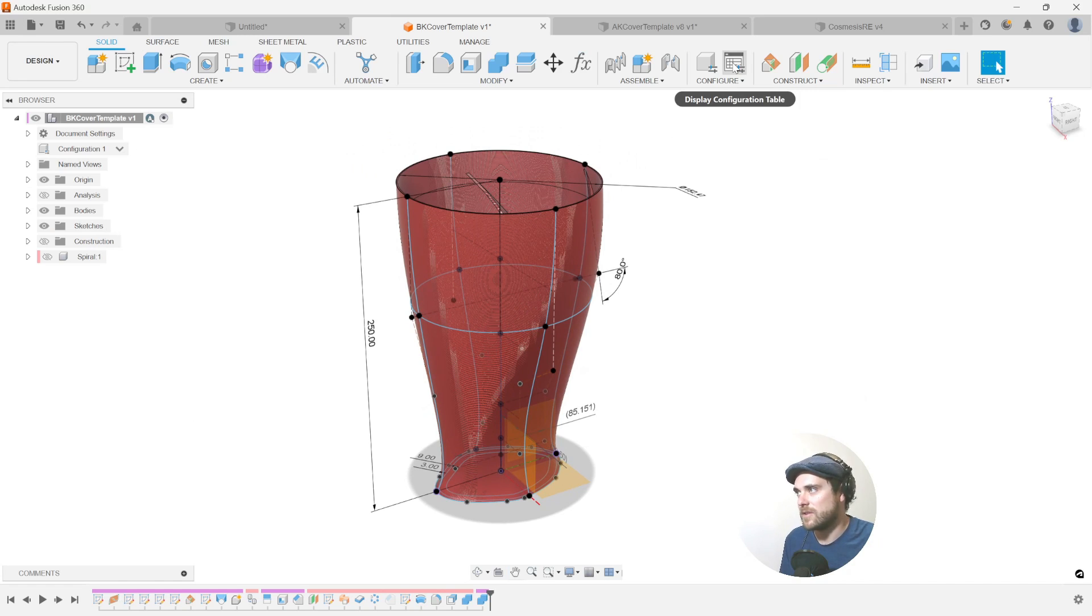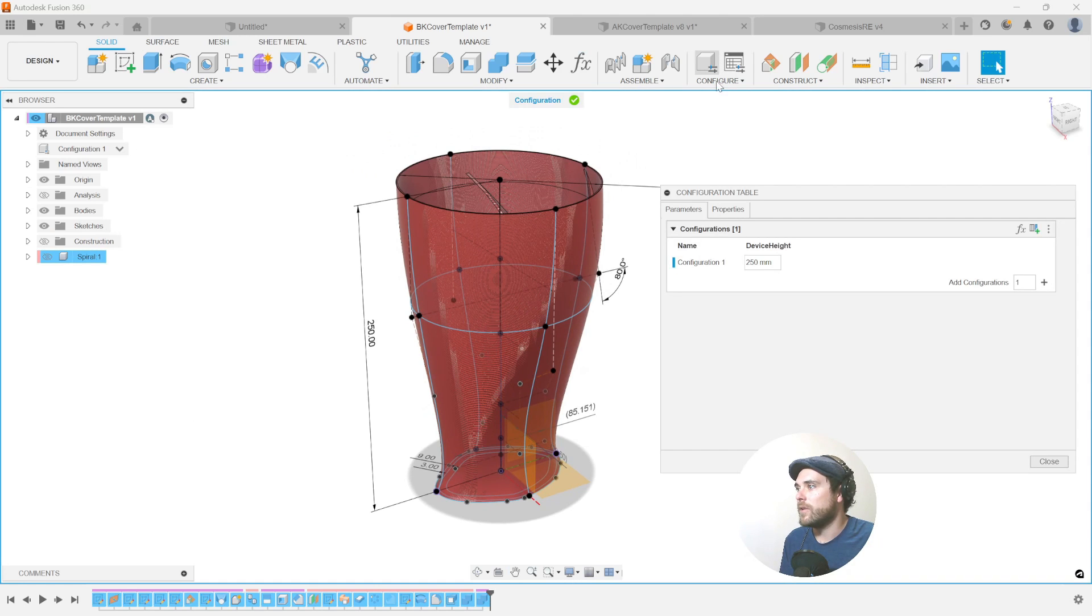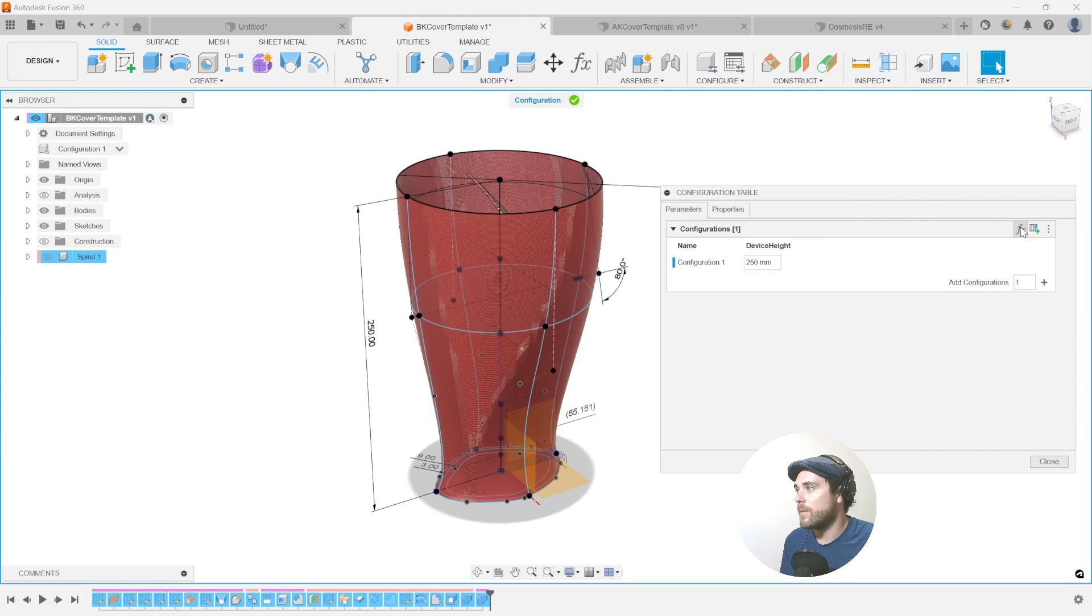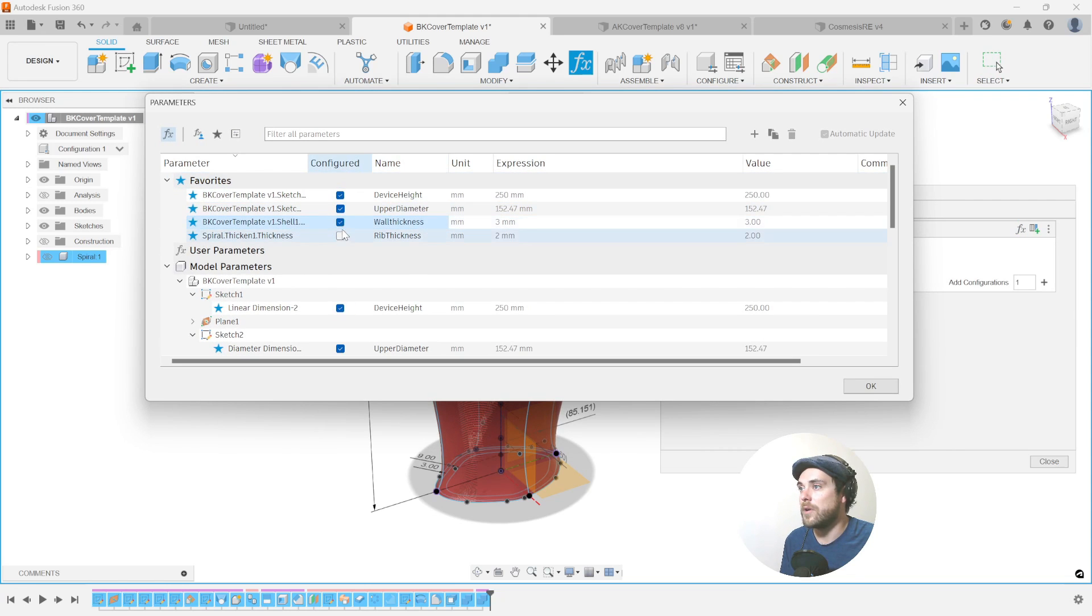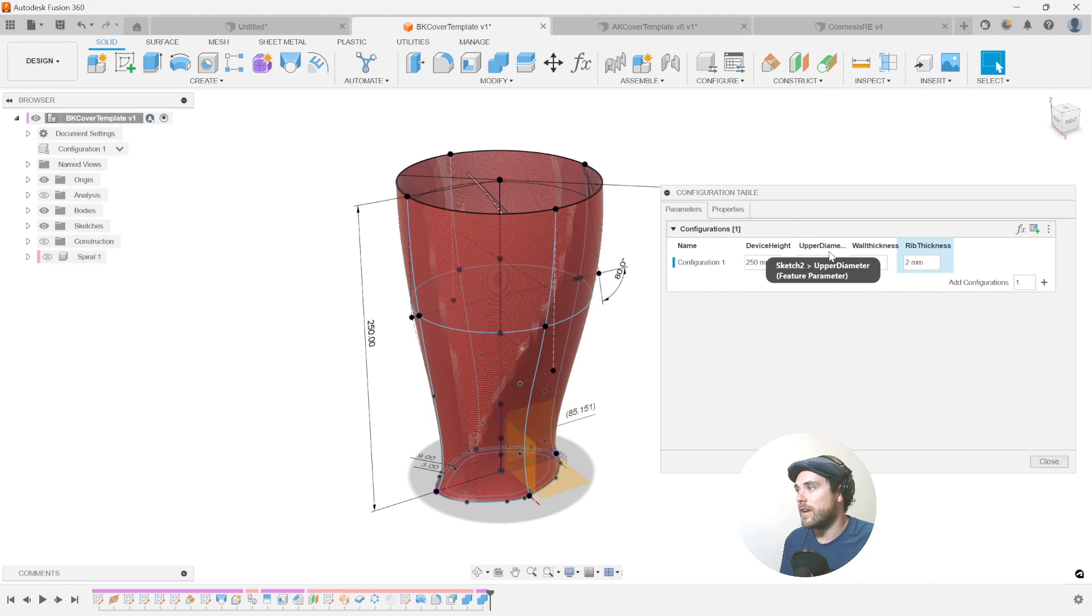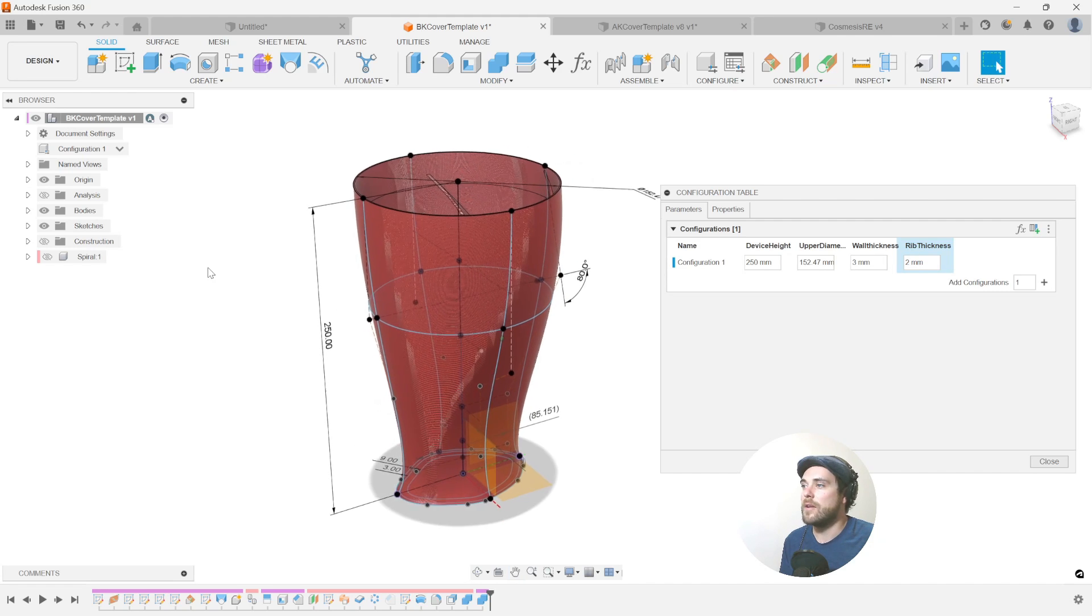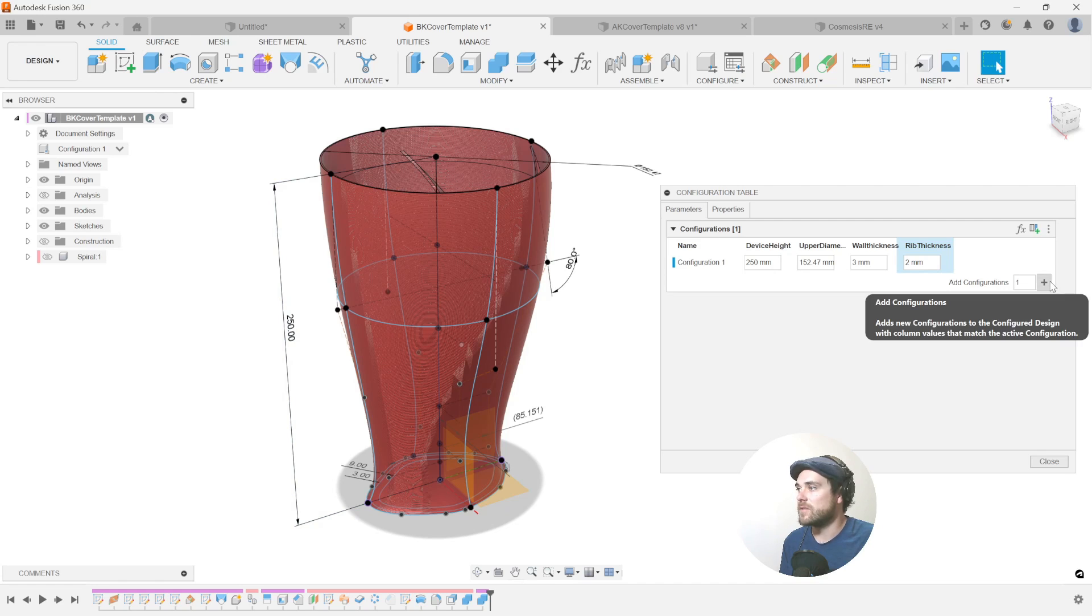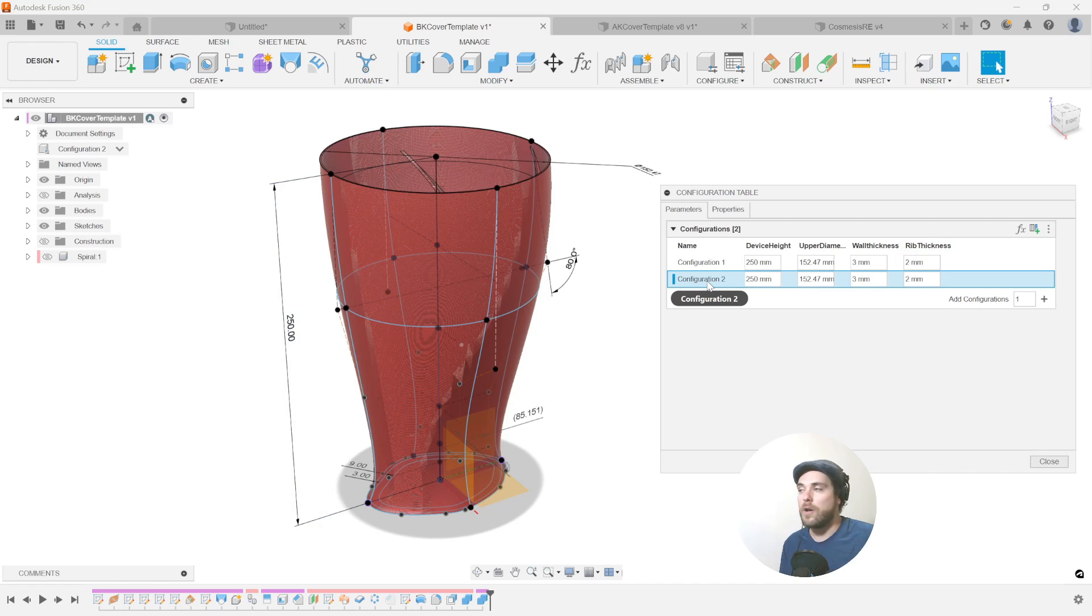But in the configuration tab, it's just a little bit easier. So if we want to bring the configuration now to all of those features, let's go into the parameters window here and let's check off all of the ones that we just labeled as being important and gave a name using our parameter window. Right. So this configuration now has device height, upper diameter, a wall thickness and a rib thickness as variables that we can start to play with when we want to program in different versions of this.